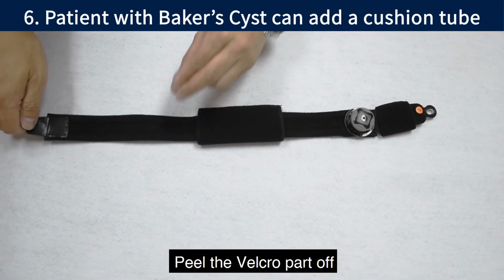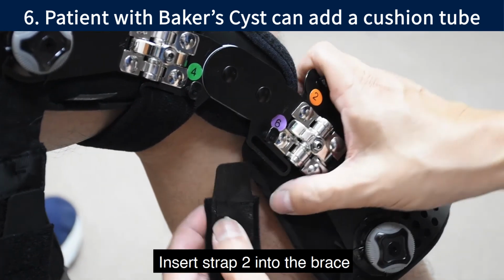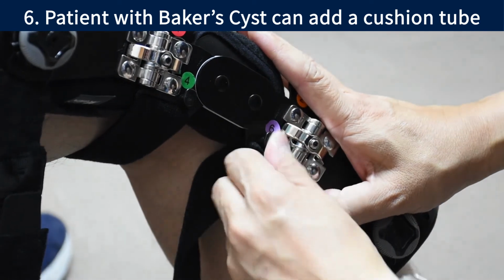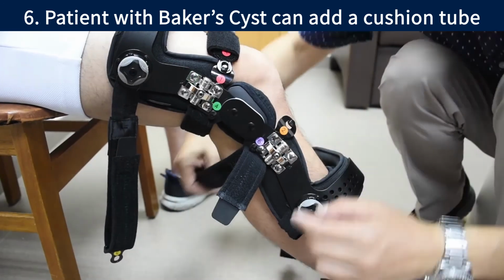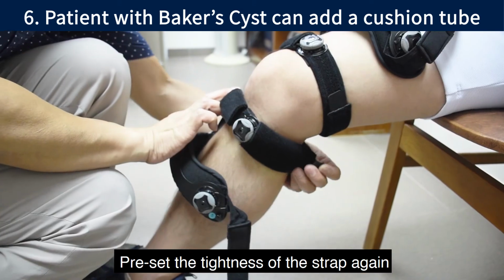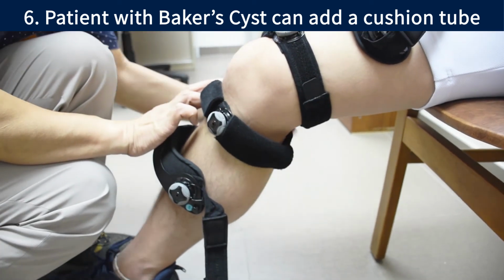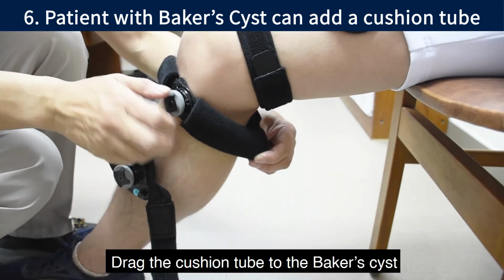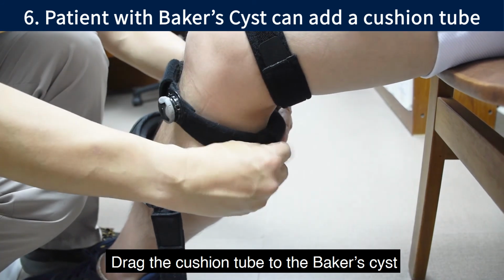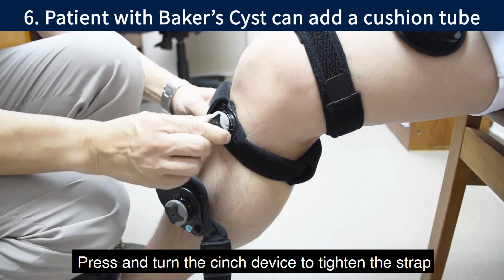Peel the Velcro part off. Insert strap 2 into the brace. Preset the tightness of the strap again. Drag the cushion tube to the Baker's cyst. Press and turn the cinch device to tighten the strap.